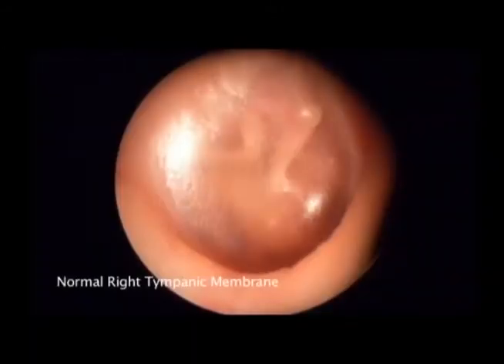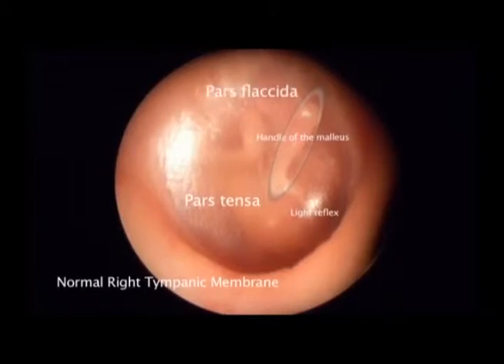This is a normal right tympanic membrane. On a normal tympanic membrane, you should be able to see the handle of the malleus, the light reflex in the anterior-inferior quadrant, and the pars tensa. You should look superiorly to see the pars flaccida also. Gently remove the otoscope, continuing to observe the ear canal for any pathology that may have been missed on the way in. Repeat the examination on the other ear.